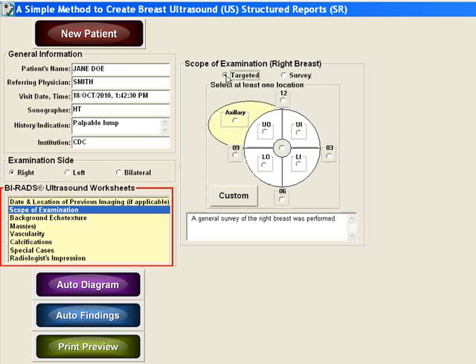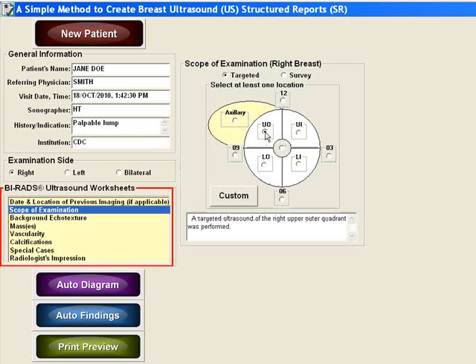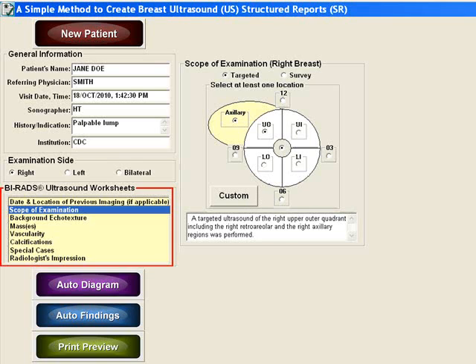If it is a targeted study, click on the word targeted, then choose the appropriate quadrants, axilla, and retroareolar regions. If it doesn't fit into one of these areas, click on the custom button to type in the specific location that you examined.